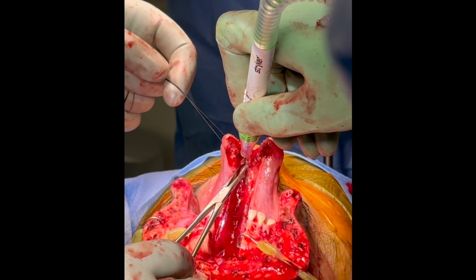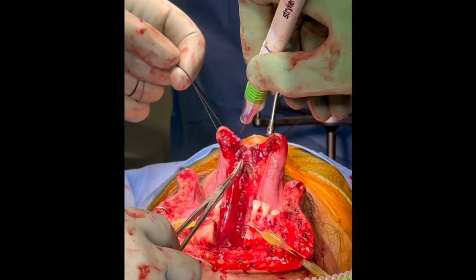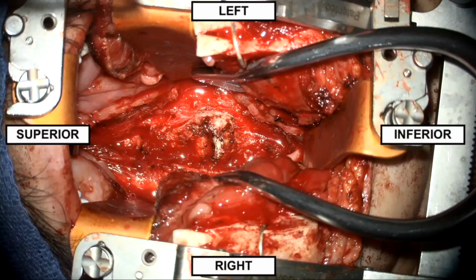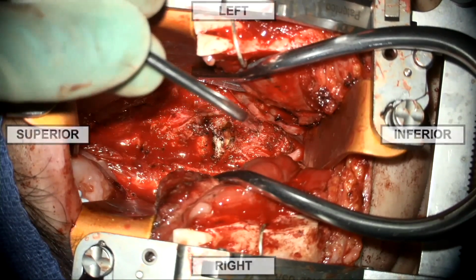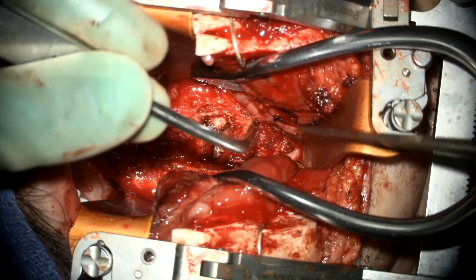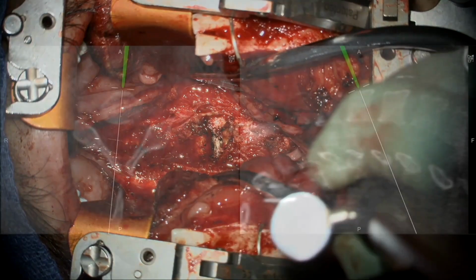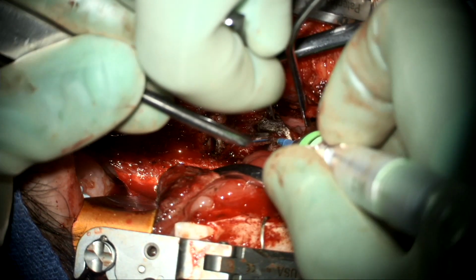Next, the tongue was divided along the midline, along with the posterior pharyngeal wall. This exposed the anterior prevertebral musculature. The prevertebral muscles were divided to expose the C1 through C5 vertebral bodies. Next, an intraoperative CT spin was obtained and neuronavigation was registered to confirm the correct levels for exposure.